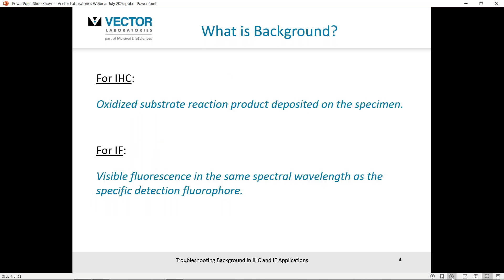For immunohistochemistry, we're speaking about the oxidized substrate reaction product deposited on the tissue specimen — for example, DAB staining observed in a non-specific manner. For immunofluorescence, we're referring to visible fluorescence in the same spectral wavelength as the specific detection fluorophore. For example, if you're using a fluorescein or FITC-conjugated green fluorophore, you may also see some interfering green fluorescence in that same wavelength.